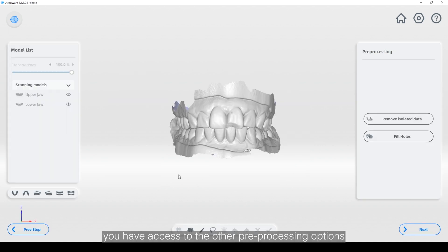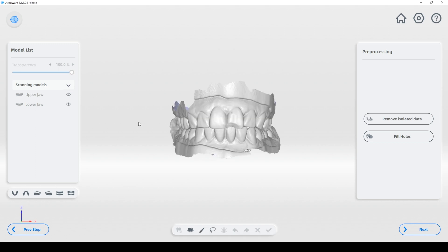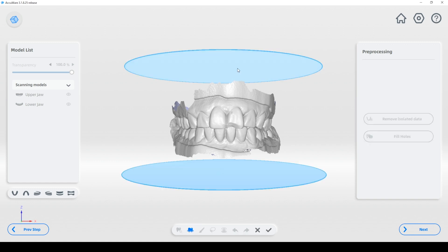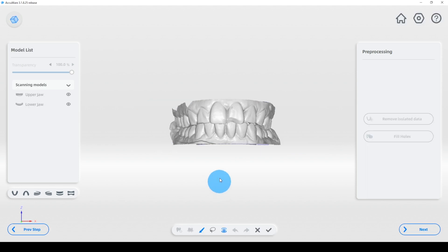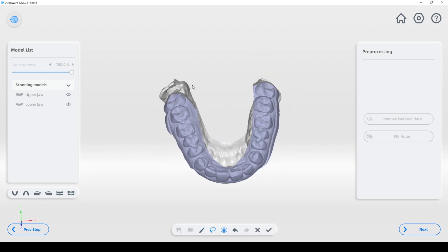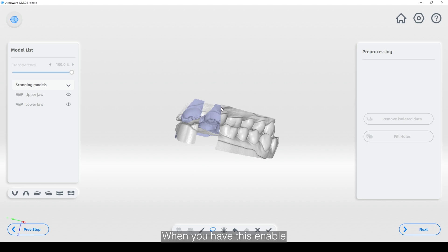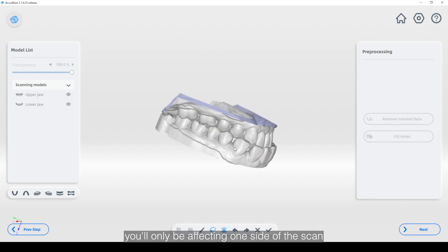On the following screen you have access to the other pre-processing options. On the left side of the screen you will see the model list, where you can adjust the opacity of the scan data for the upper and lower jaw. You also have camera controls in the bottom left, and many tools for editing the data including the plain cut, the brush tool, the lasso tool, and the cut through option. When cut through is enabled, any data that you edit will go all the way through; if disabled you'll only be affecting one side of the scan.